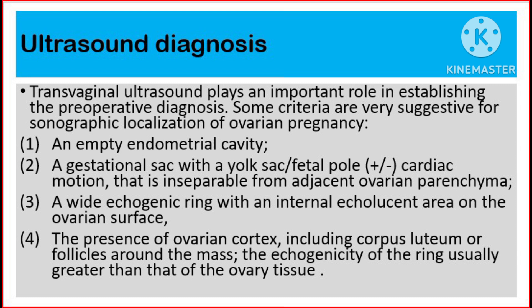Number 4: The presence of ovarian cortex, including corpus luteum or follicles around the mass. Number 5: The echogenicity of the ring is usually greater than that of the ovarian tissue.